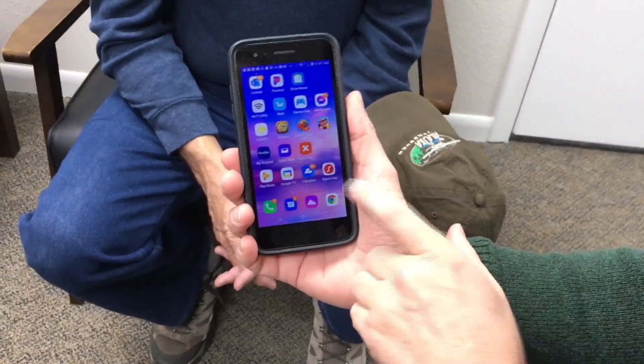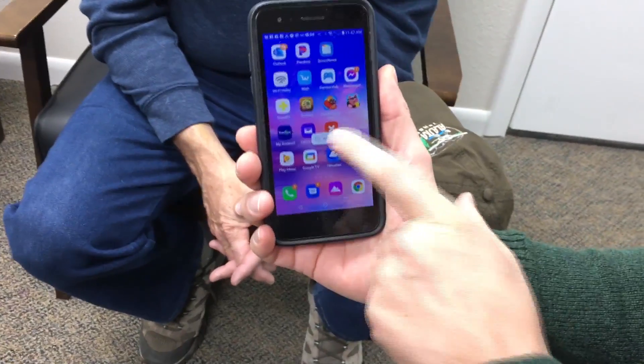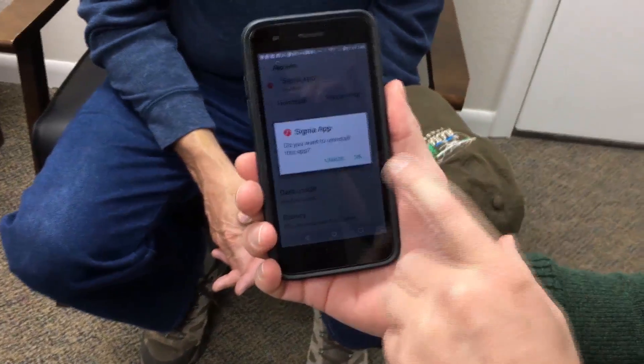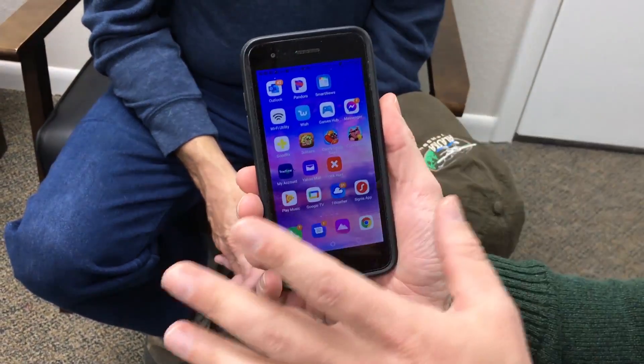Here is his app on his phone. What we're going to do is push and hold, and then hit App Info. We can then uninstall the app. It asks just to be sure, so we'll say OK, and let it go ahead and delete.